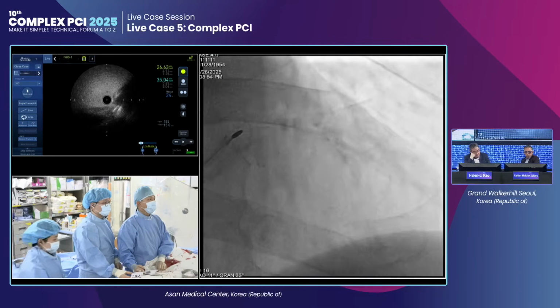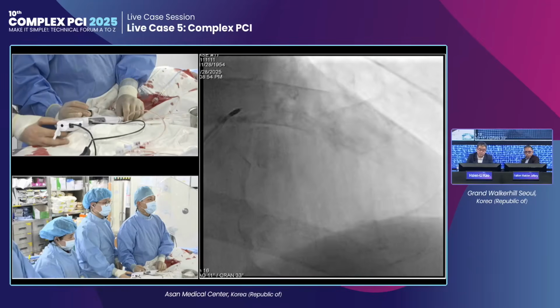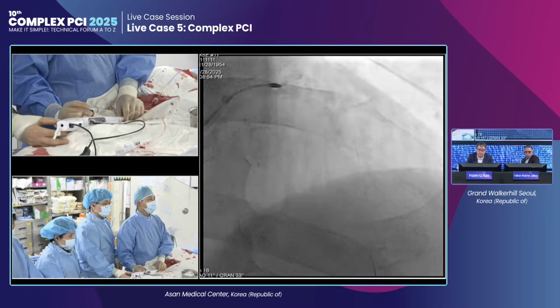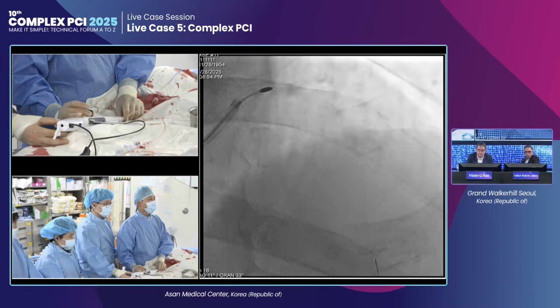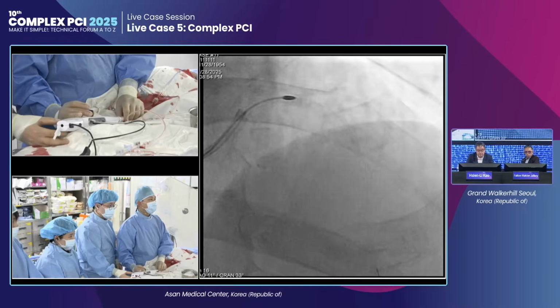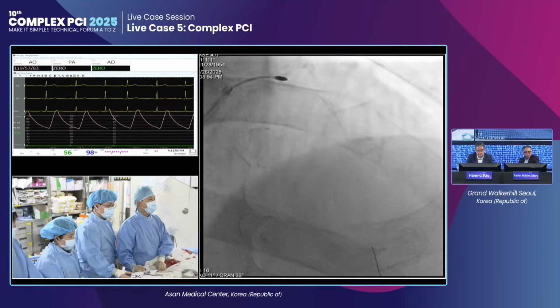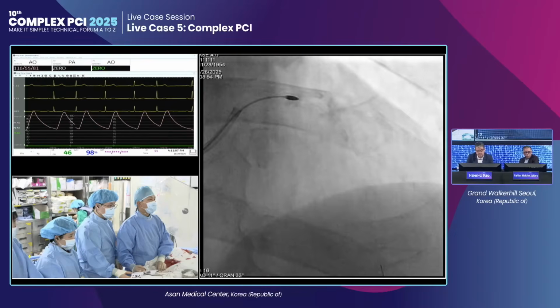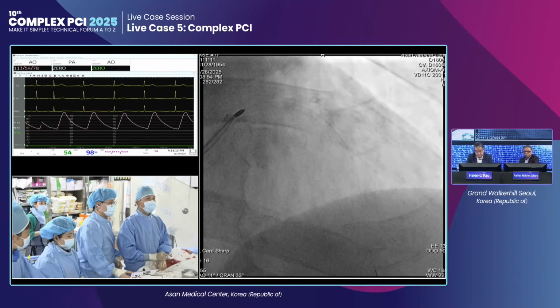That's right. This is 1.5. Okay, and I will begin. So I ablate it. Here is the point. Yeah, there's strong resistance. The patient's vital sign is okay. Heart rate is 60. And still resistance. What speed are you ablating at? I will stop. It's 180. 180? 180.